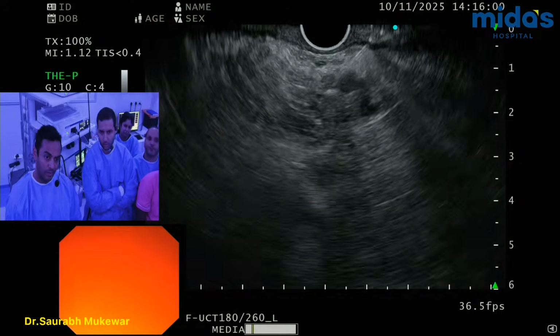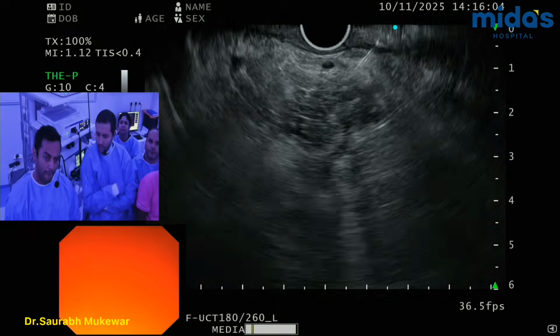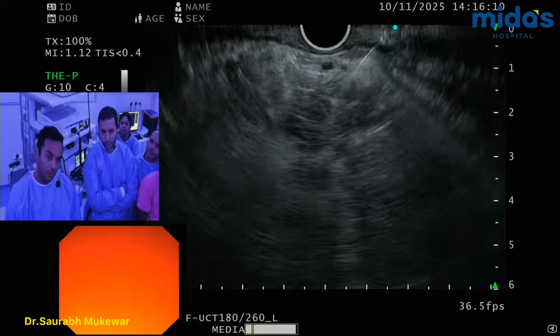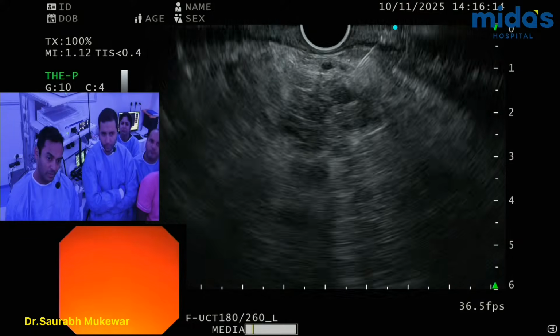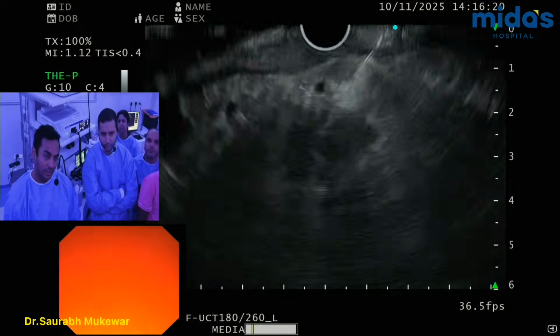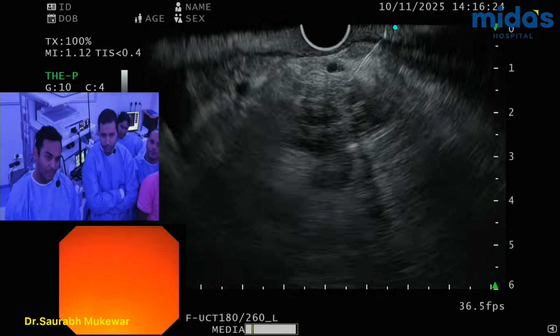To have a good pathology result, do you like to do 2 times the biopsy or 3 times? Yeah. So the way we do it now is with a macroscopic evaluation, which is what we term as MOSE, M-O-S-E, whereas ROSE has given way to MOSE now, where you just visualize how it looks and then take a call.